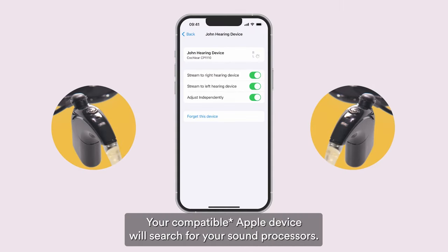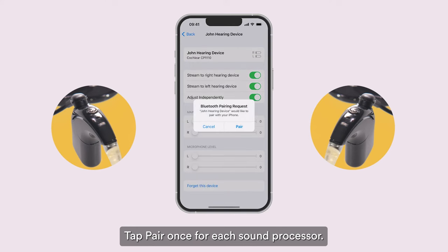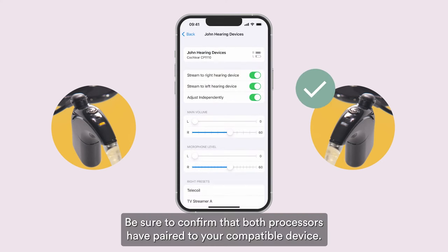Then turn both processors on again. Your compatible Apple device will search for your sound processors. Tap Pair once for each sound processor. Be sure to confirm that both processors have paired to your compatible device.